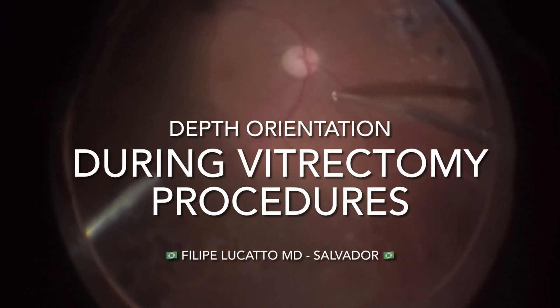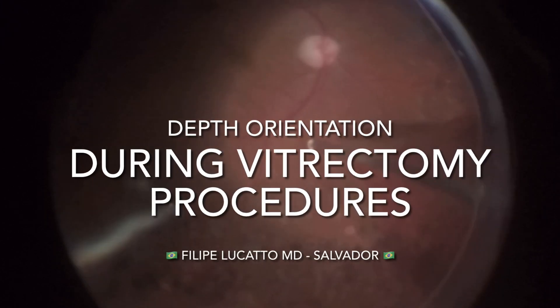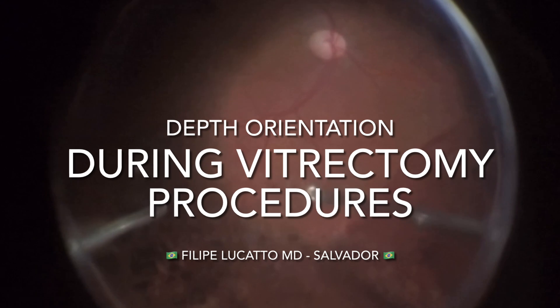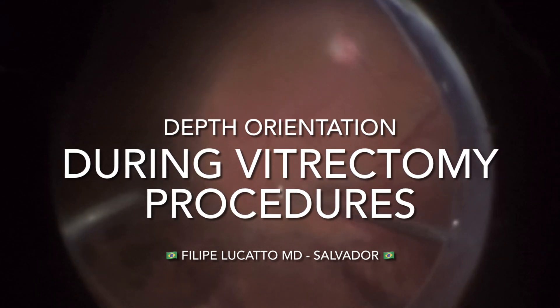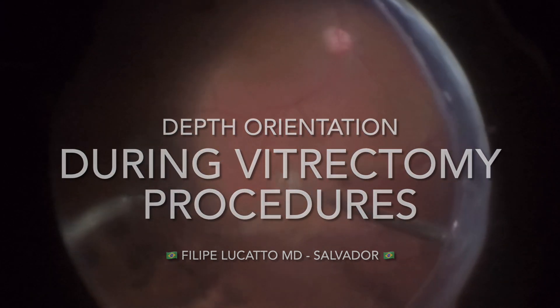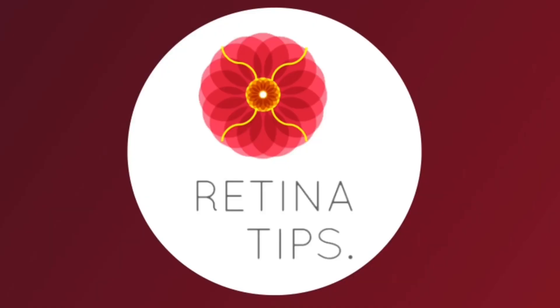A challenge for retinal surgeons in training is related to the notion of depth of the instruments during vitrectomy procedures. In this video, we discuss tips on how to increase safety by improving depth perception.